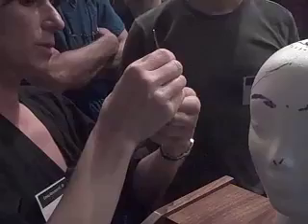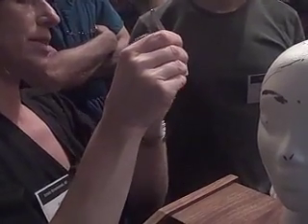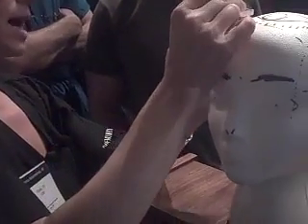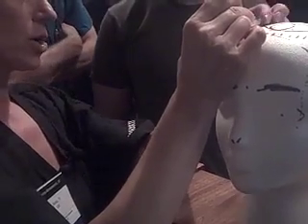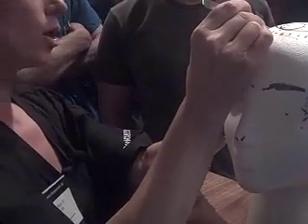The same thing, if I turn on the other side, now my forceps will come in the front of my graft, which means the curl points inside of my graft, and I'm going to slide it in. I can also hold it from this side and slide it in, as long as I'm aware where my curl goes. Two things that I have to be aware of: my curl, and the angle of my forceps, always matching the angle of your site.